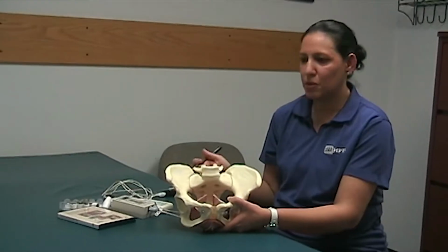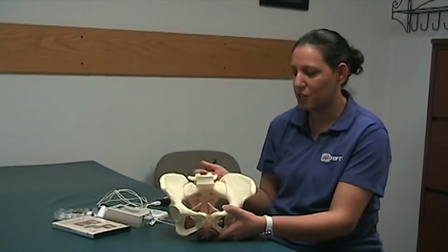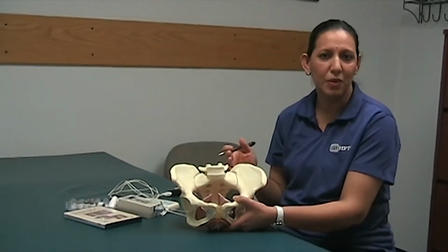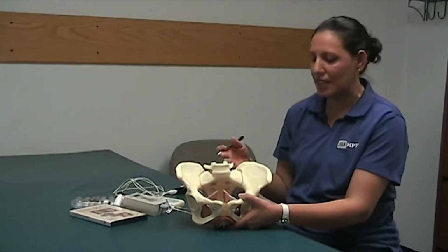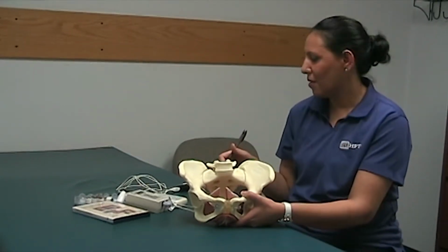In functional positions, we would try to determine where their accidents are happening during the day. So say a patient tells us that their accidents are happening when they squat, then we would do Kegel exercises in squatting, and they can see their contractions on the screen.